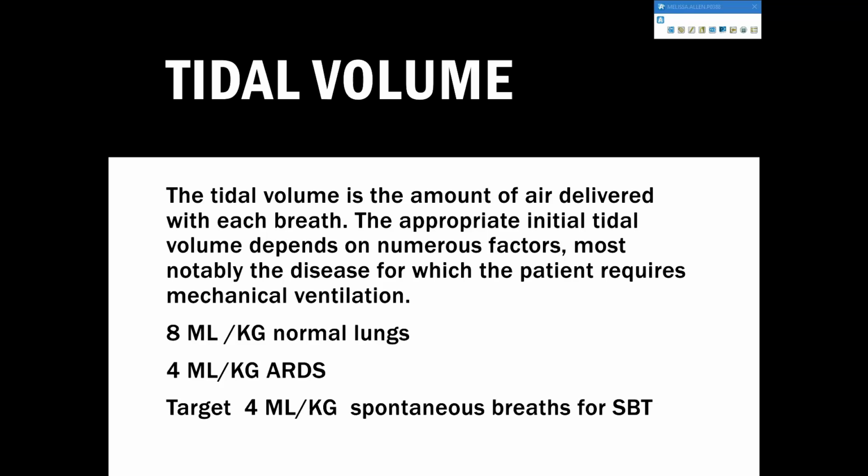Talking about ARDS, we don't want to expect the unrealistic from these really damaged lungs in ARDS. So we are going to be targeting that 4 to 6. I mean, it's going to be an average, but 4 mLs is okay.